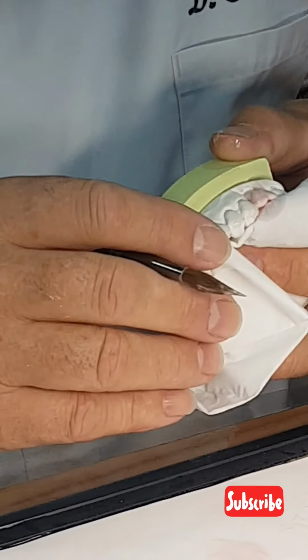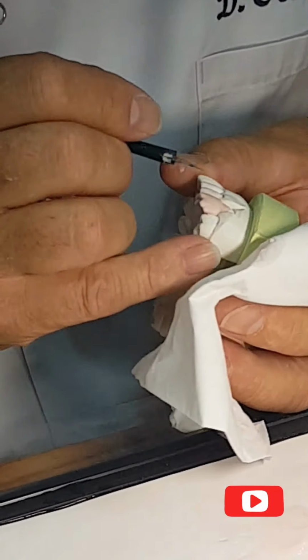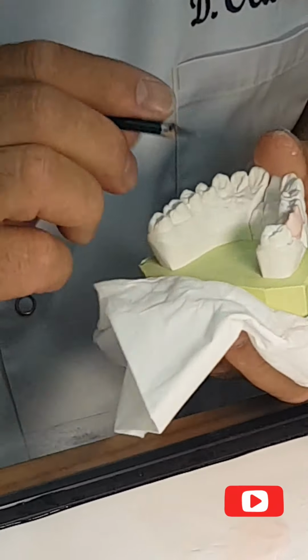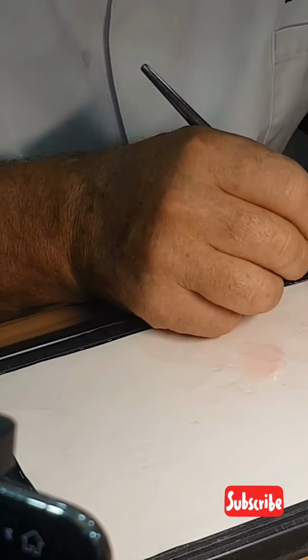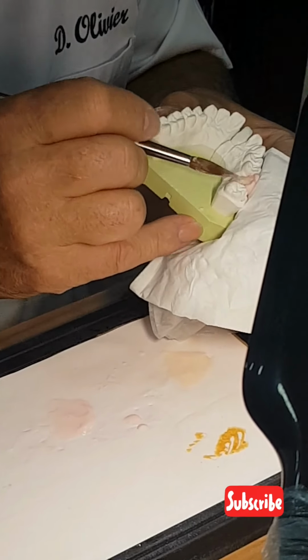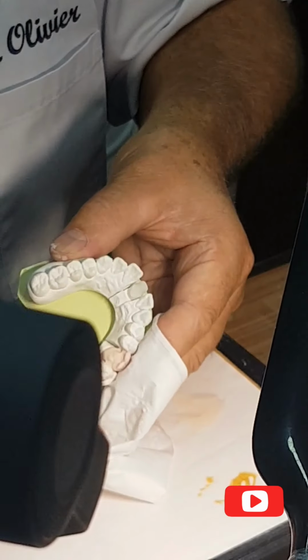I go very fast. I don't try to give a perfect shape or the good volume. I work with my spatula as clean as possible. And I continue. In that area, in the depth, I introduce my orange mixture, and behind it always a little more orange than in the rest of the crown. I continue my dentine build-up.